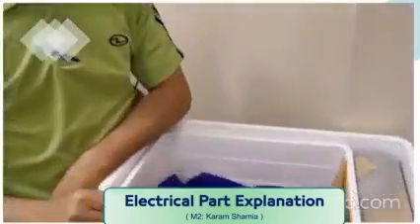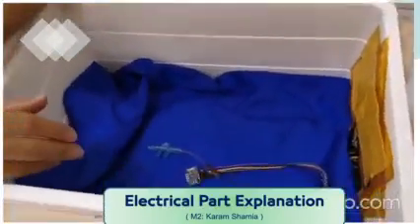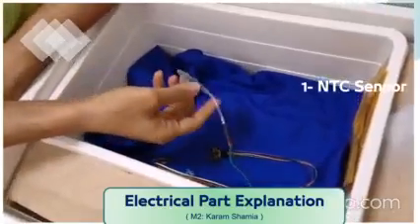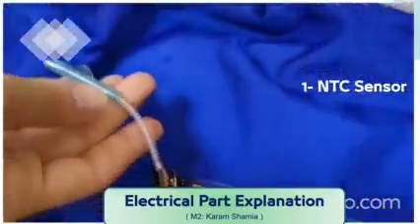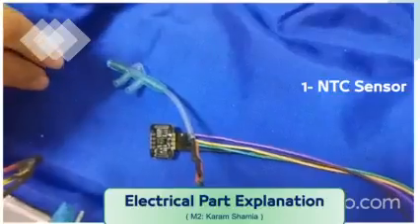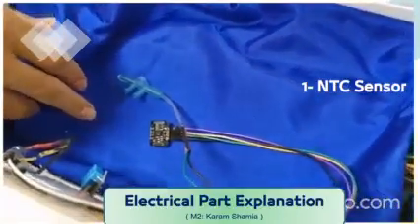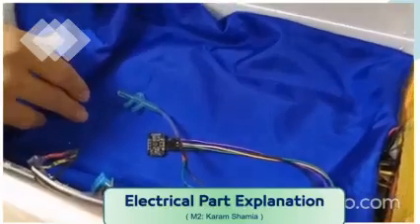I am member 2 of Team 12. In this part, I will explain how our sensors work in our project. First of all, I will start with the NTC sensor. This sensor will detect if apnea happens. So if apnea happens, it will send data to the controller, and the controller will give an alarm in the maintenance room.